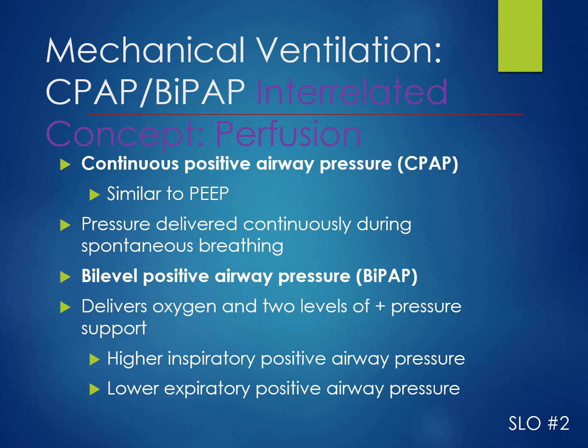BiPAP is our other mode. BiPAP provides two levels of support. So it delivers continuous air on inhalation, but then it lowers that pressure so that the patient is able to exhale easier.